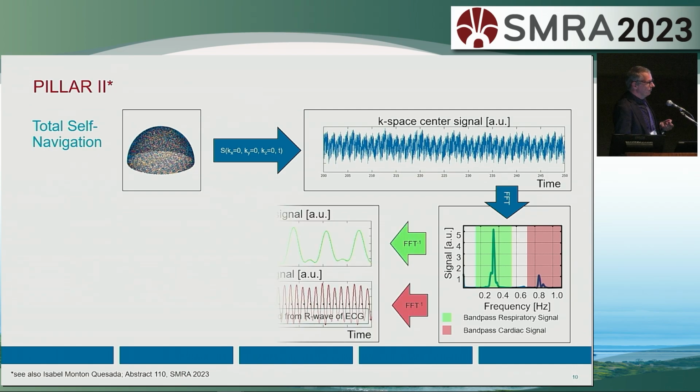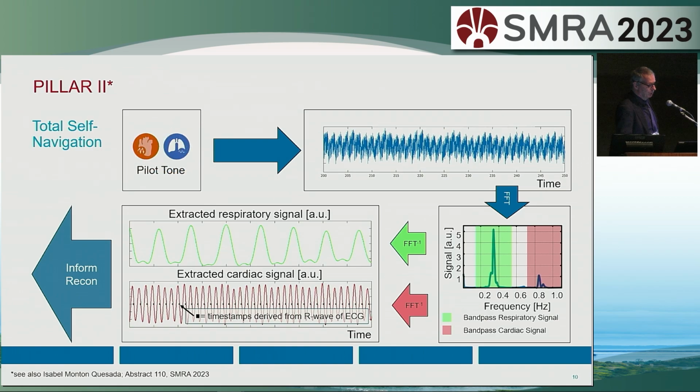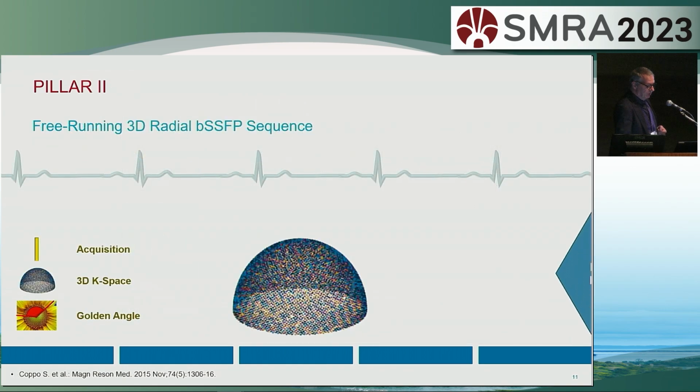Now you can back transform this into the time domain and extract cardiac and respiratory signals, which can then be used to inform reconstruction. Simultaneously, if you're so inclined or if you have the hardware, you can actually also inject the pilot tone signal into more or less the same exact pipeline to do again the same to inform the reconstruction.